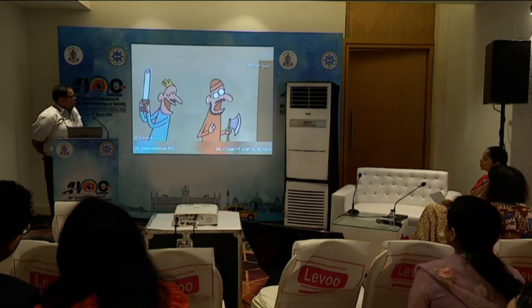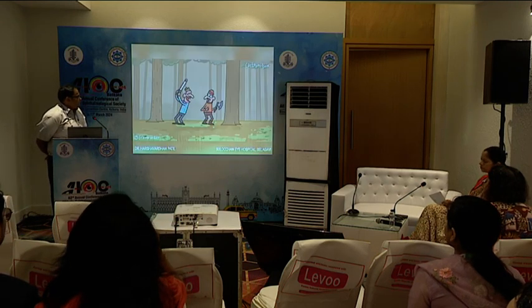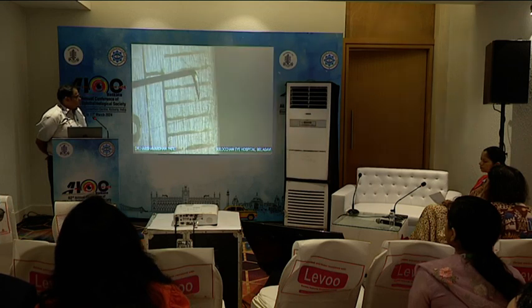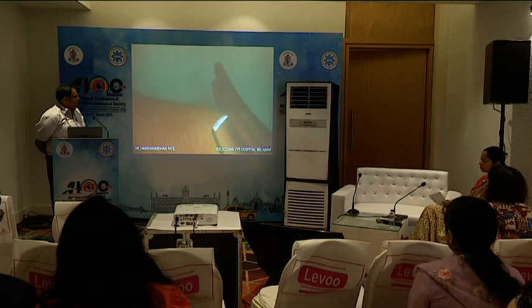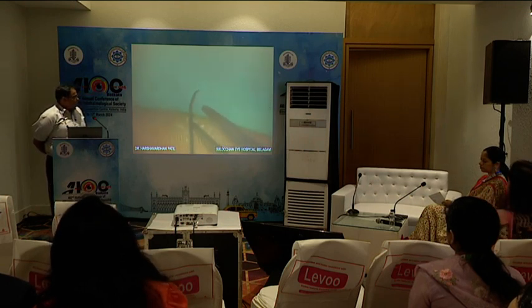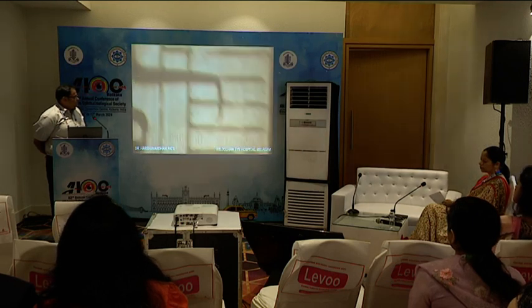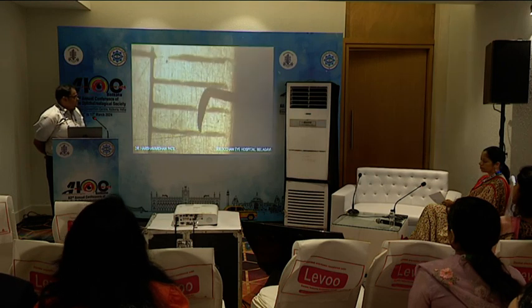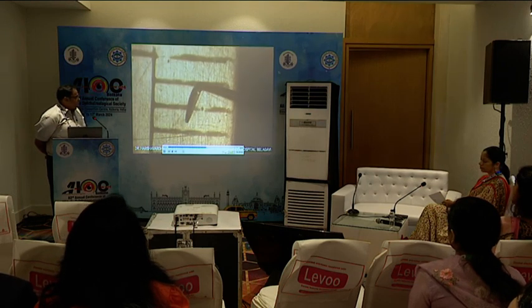So it would be best if you have an instrument like this, an electric saw, which cuts trees within seconds. So based on this idea, I took a long diagonal Chang's chopper of around 2 to 2.5 mm, you can also use, and bent the tip of around 0.3 to 0.5 mm slightly towards the left side in the form of a sickle. So the sharpness of the chopper is not lost, whereas you get a good lateral bend of the chopper. This is how it looks under the microscope.